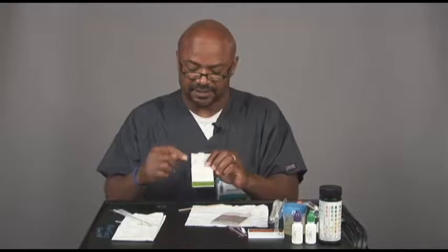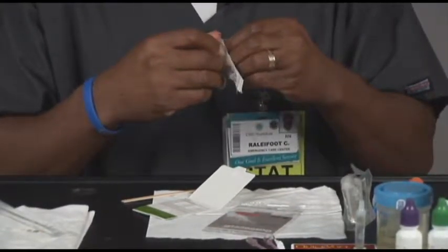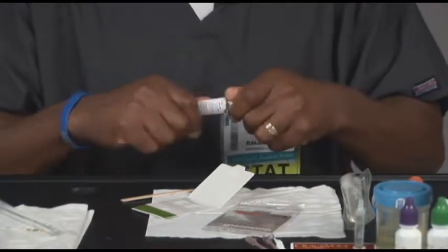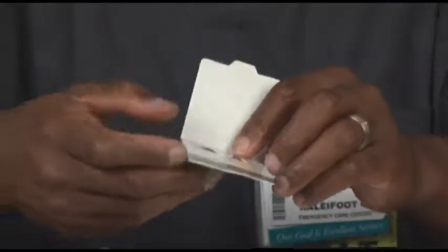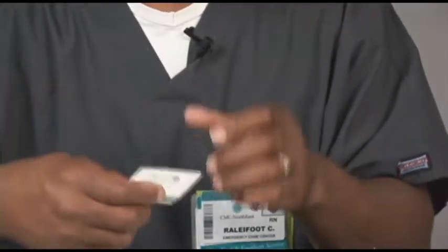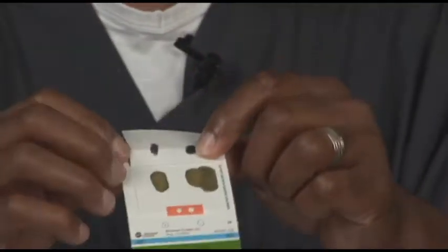And you would place the specimen in both of these windows. We're going to use some fake stuff here to perform this. So you get just some poop, bowel movement put on there. You would close the window, close the cover. The manufacturer recommends that you wait about 3 minutes prior to actually applying the developer. You would open the other side. Normally you would not have color change like this immediately.